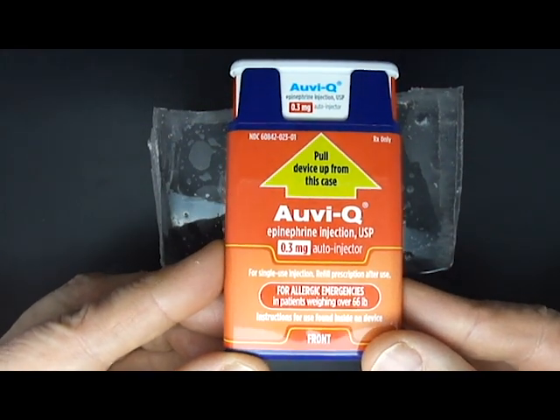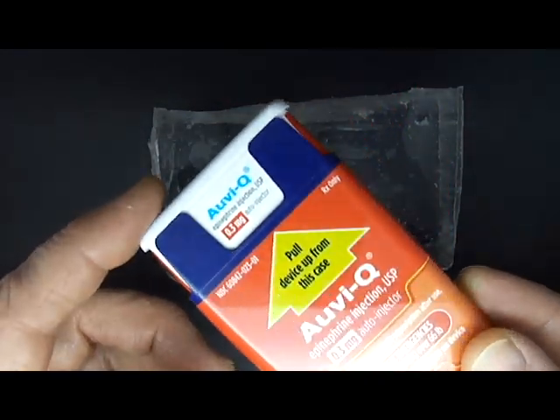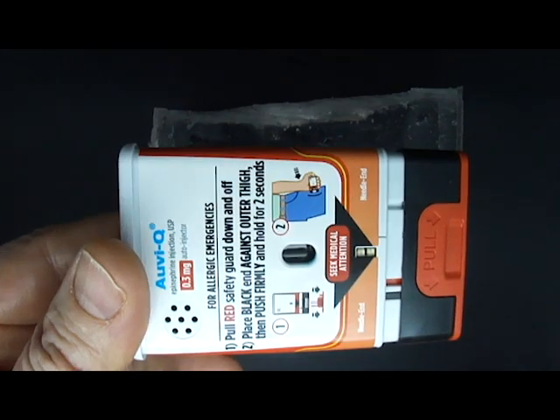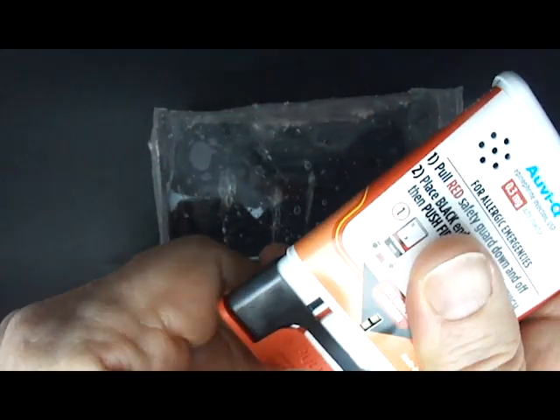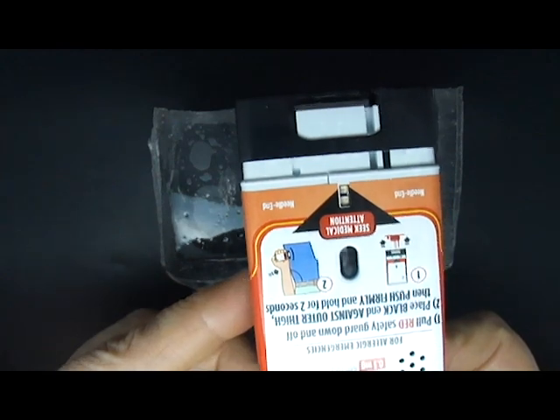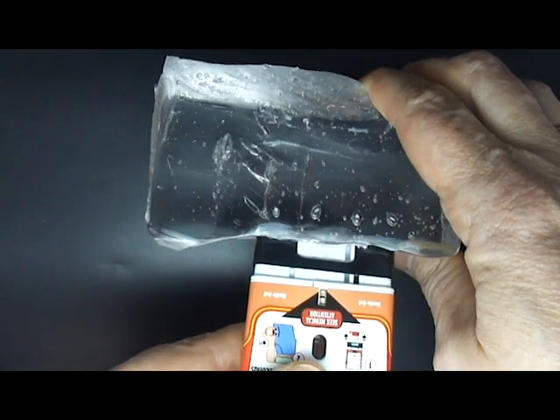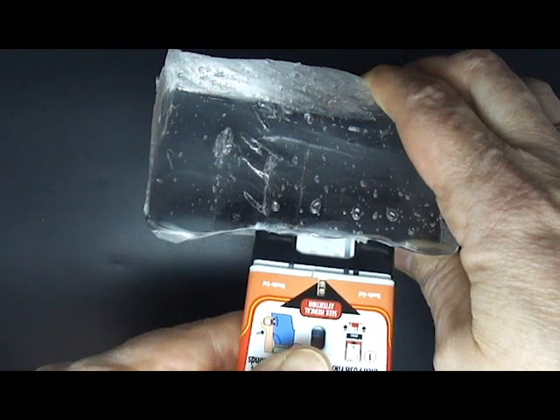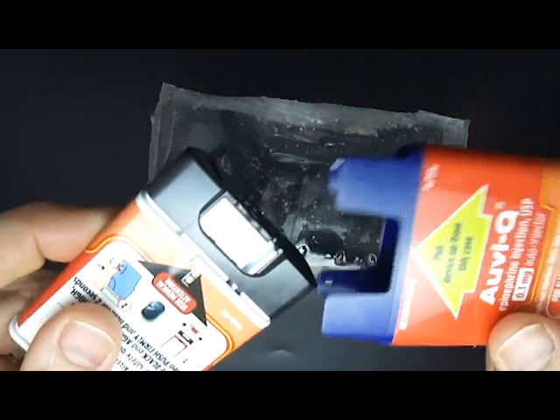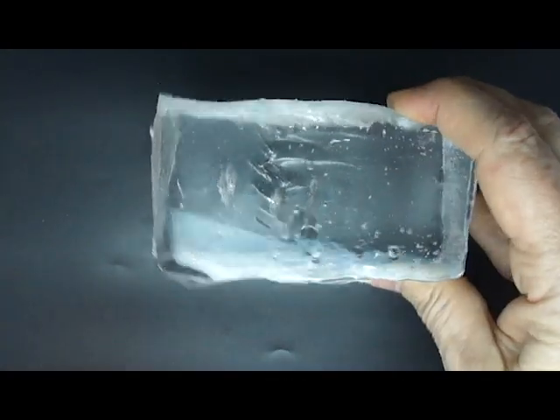Next we have Kaleo's AviQ, and for purposes of demonstration I'm going to wait and let you hear the prompts, although you don't actually have to wait for the prompts to use this device. [Device prompt:] 'If having an allergic emergency, pull red safety guard down and off of AviQ. Place black end against outer thigh, then push firmly until you hear a click and hiss sound and hold in place for two seconds. Injection complete. Seek emergency medical attention.' The needle retracted as soon as the injection was complete and retracted right back up into the device.